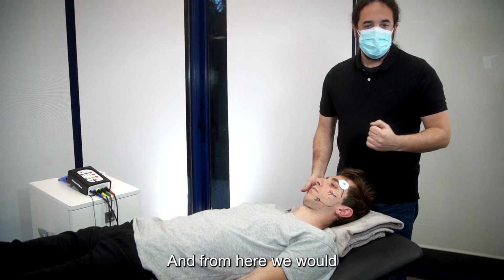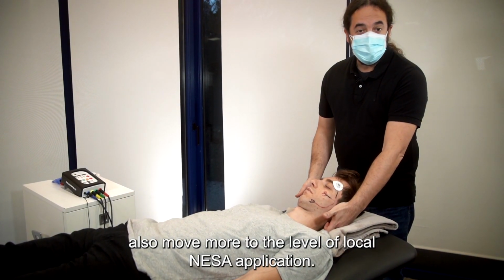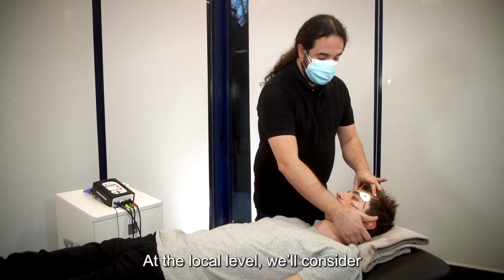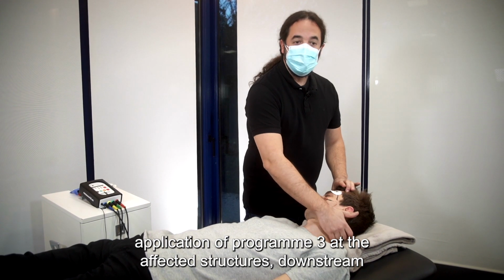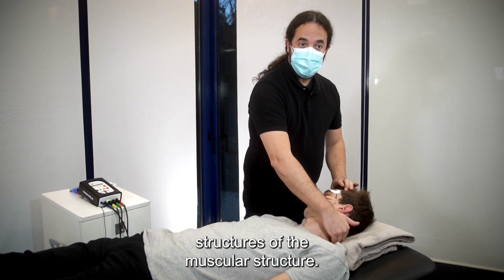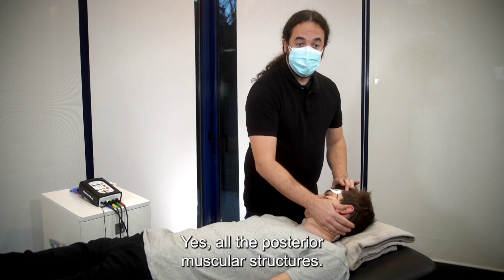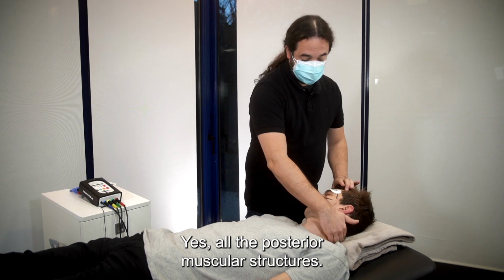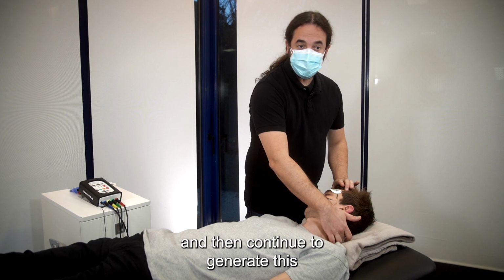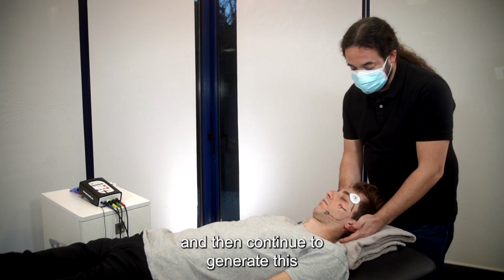And from here, we'd also move more to the level of the local NESA application. At the local level, we'll consider application of program 3 at the affected structures, downstream structures of the muscular structure. That's right, all the posterior muscular structures. We'll set program 3 for some 15 minutes, and then we'll continue to generate this traction work.